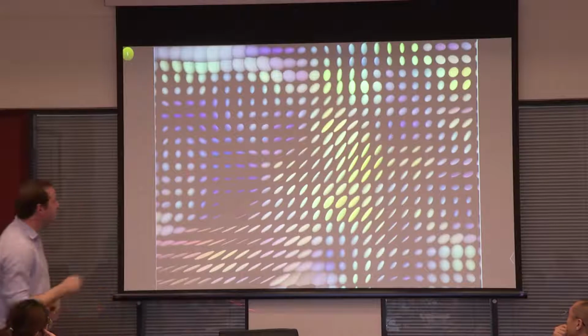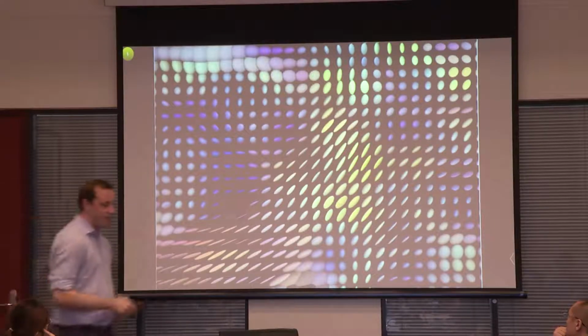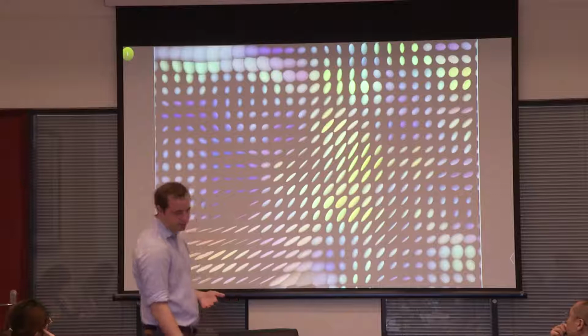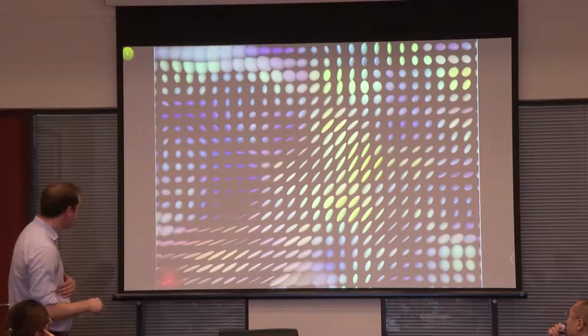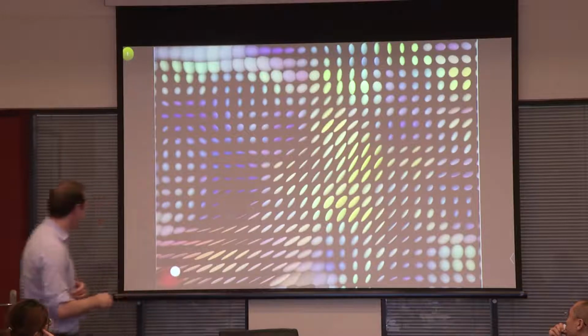Okay, so this is a two-dimensional set of tensors now. And maybe you can see there's a strong direction here, so there could be fibers going in this direction, but then maybe there's more water here, or there's not so much information here or up here. And what the tractography now does is to start at one point, and then we just go from voxel to voxel, right?